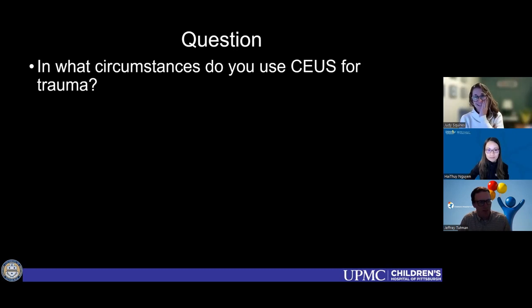Yeah, we occasionally have those cases with a very high degree of suspicion for some traumatic injury, and I don't think we'll ever get away from doing CT in those. But for the ones with a low to moderate mechanism of injury where they want to do some kind of imaging, oftentimes they'll just order a grayscale ultrasound, which we know has very poor sensitivity. I've thought about those scenarios where they want some kind of imaging but haven't met the threshold that they need a CT. I thought it might have some applications in that scenario, but same thing, we're not quite there yet. I think that's a great idea, where the pretest probability is lower.